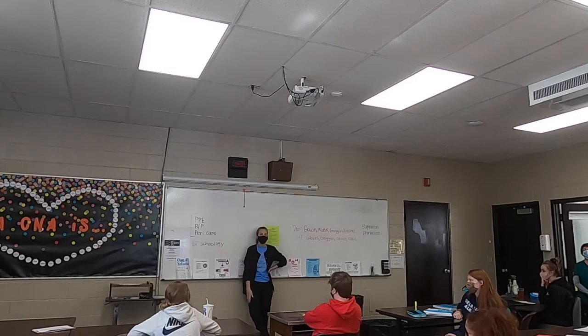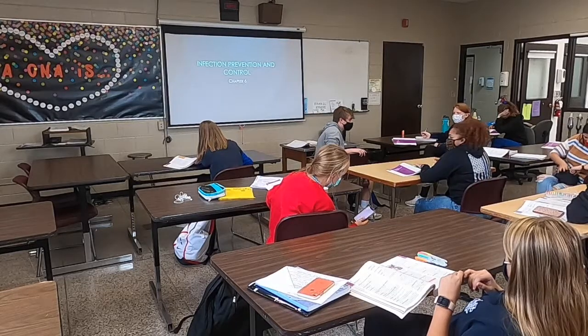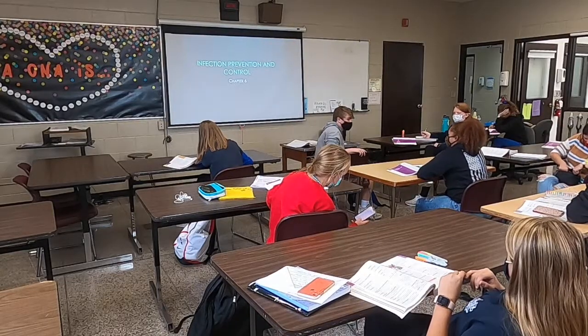There are 2 videos on Schoology that you could watch today with a partner if you choose, if you have not already. One is the one we watched in here in class, and another one is similar, but it gives you that practice of reading the gauge. Otherwise, hands-on practice with blood pressure is always best.